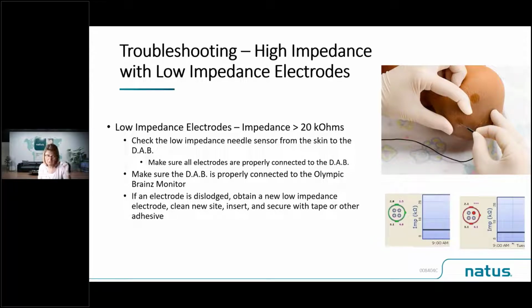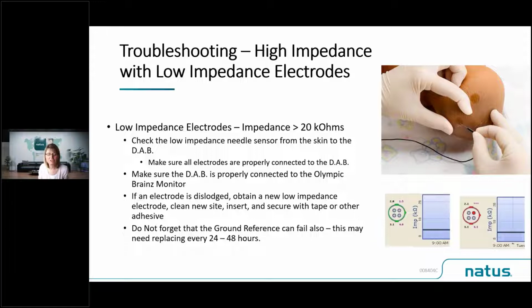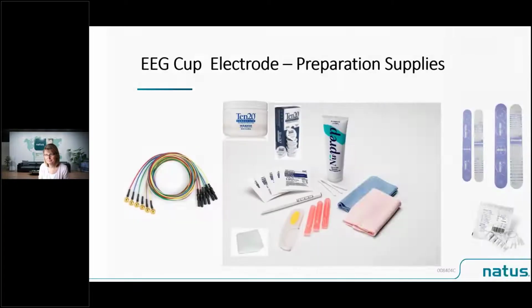We never reinsert a needle that's fallen out. So we're going to clean a new site, insert a new electrode and resecure it with tape or other adhesive. And again, don't forget about the ground electrode. Don't forget that can fail. If you think you've got issues, then you may need to re-prep and re-prepare your ground electrode site.